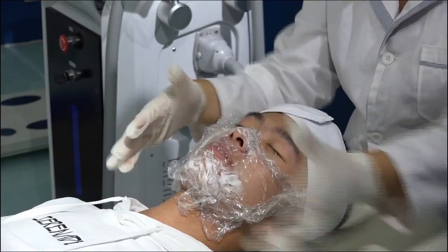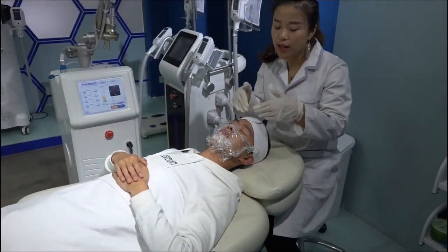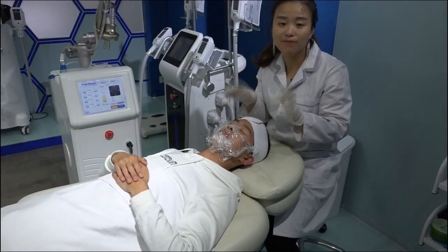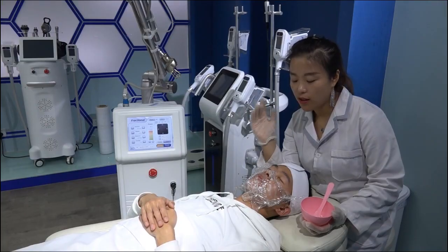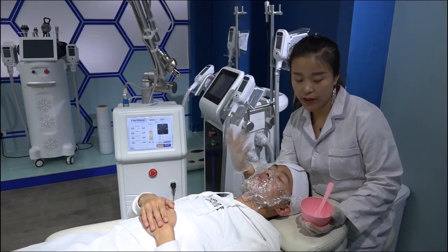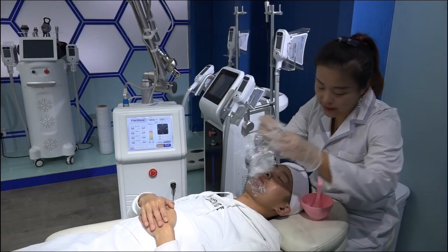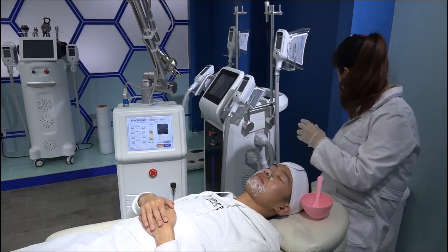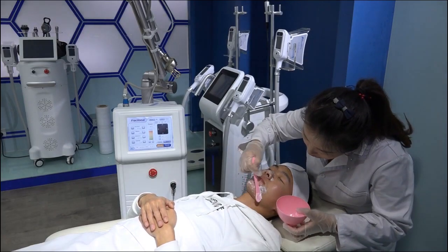I think 30 minutes is okay to numb. After that, we clean the numb cream and then we can do the treatment. Okay, now after 40 minutes have passed, the numb cream is okay. We need to clean the numb cream. Remove the plastic wrap, then remove all the numb cream.